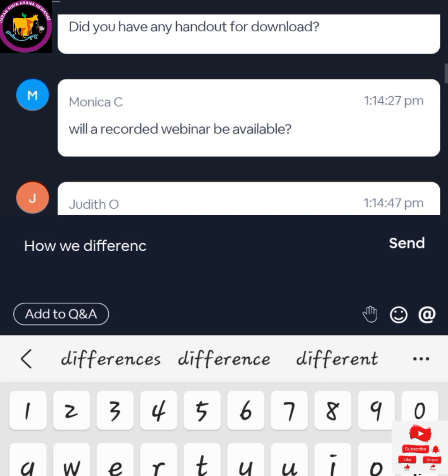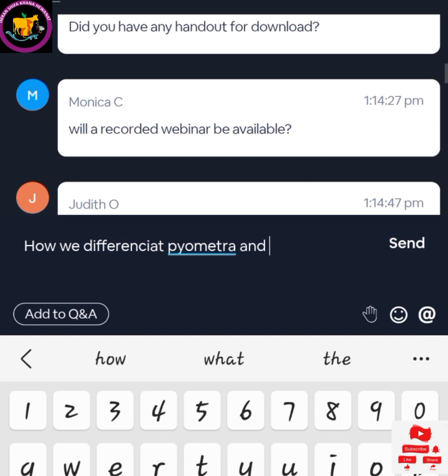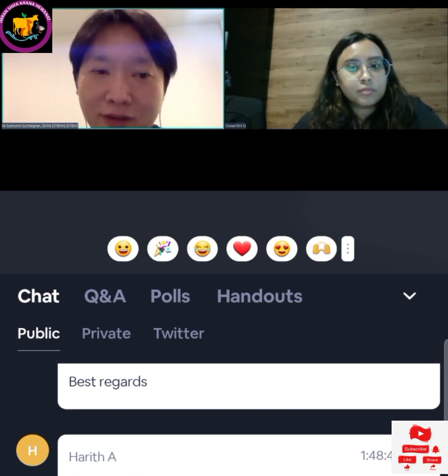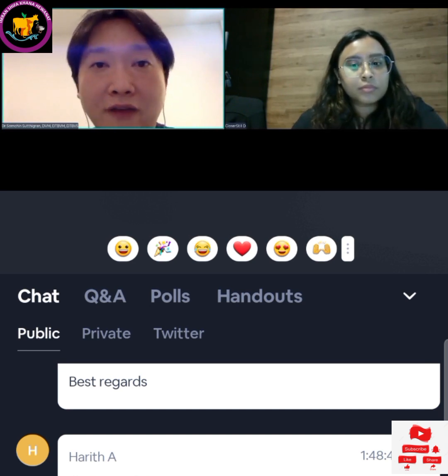That is good. For diagnosis, the pyometra sometimes looks like the gastrointestinal tract, but you need to follow the uterus to the caudal region, because in the caudal region of the abdomen you will see only 3 organs, right? Urinary bladder, large intestine and uterus. Between the urinary bladder and large intestine, you can follow the uterus to the ovary. If you can follow it, it indicates it is a uterus. It has the pyometra. And the appearance of the wall of the uterus and gastrointestinal tract is different. The gastrointestinal tract may show the 5 wall layers that I showed you in the previous presentation.